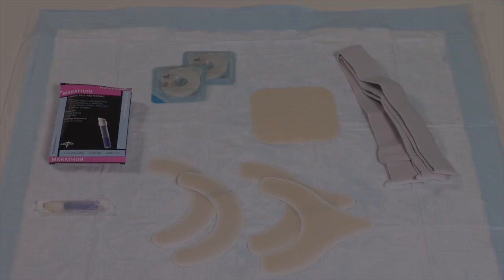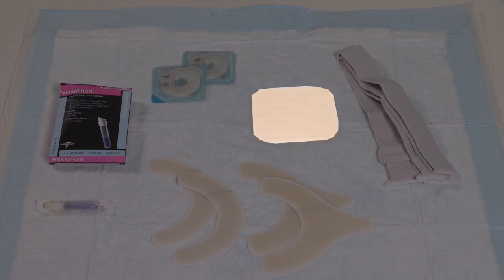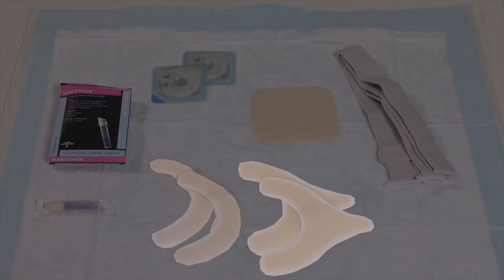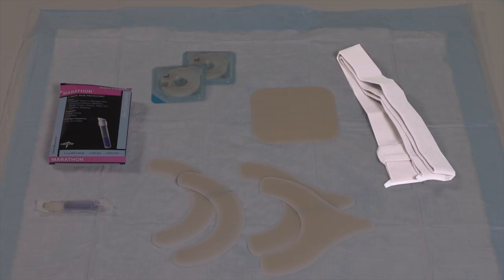You should also gather any extra supplies you're using, such as a thin hydrocolloid sheet, liquid skin protectant, thin barrier ring, elastic barrier strips, or urostomy belt.